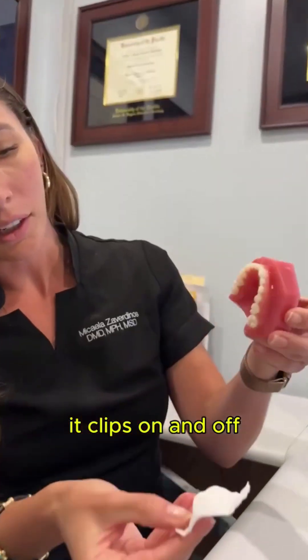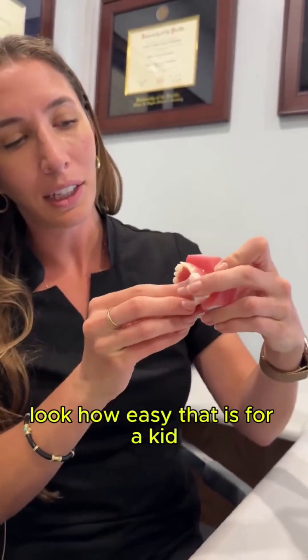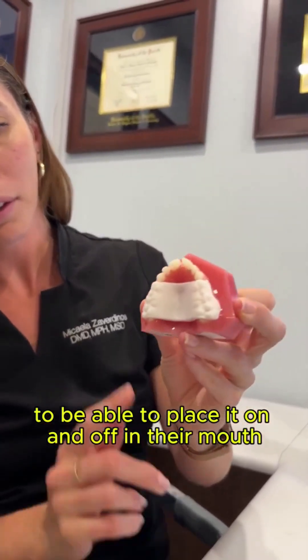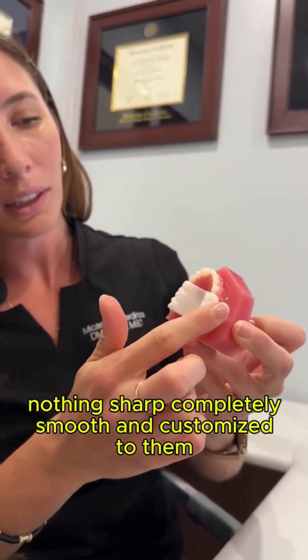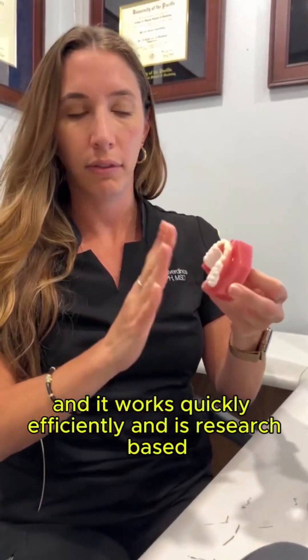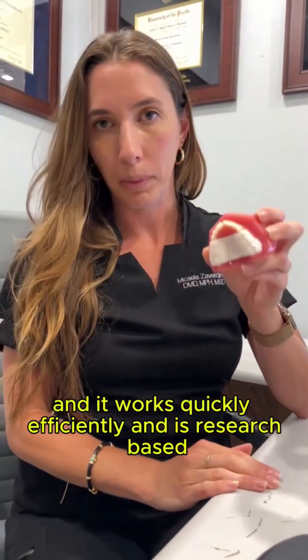It clips on and off, so even though they have to wear it all the time, look how easy that is for a kid to be able to place it on and off in their mouth. Nothing sharp, completely smooth and customized to them, and it works quickly, efficiently, and is research-based.